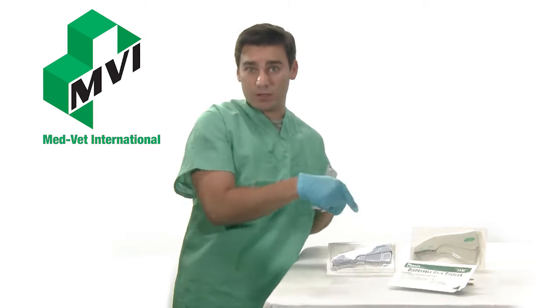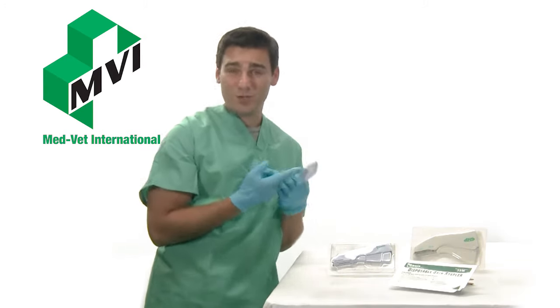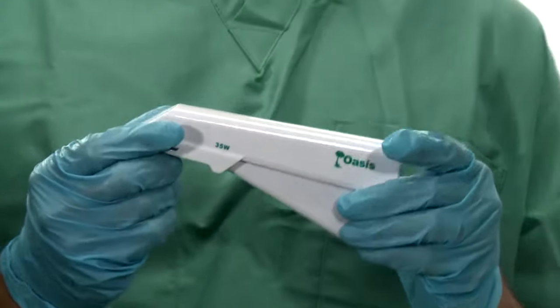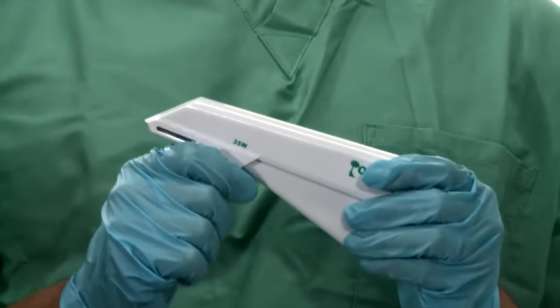The only difference between the 35R and the 35W is the size of the staples. The regular staples measure 5.4 by 3.6 millimeters after closure, and the wide staples measure 7 by 4 millimeters after their closure.